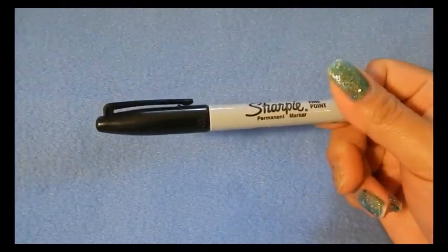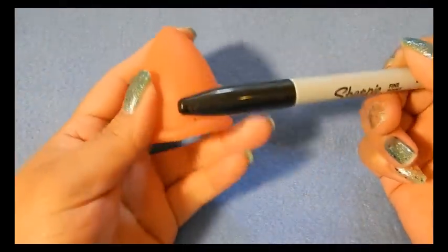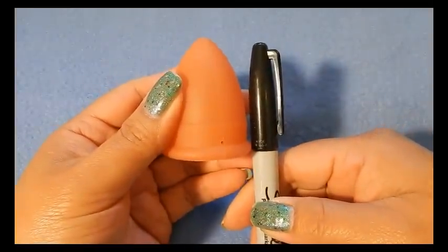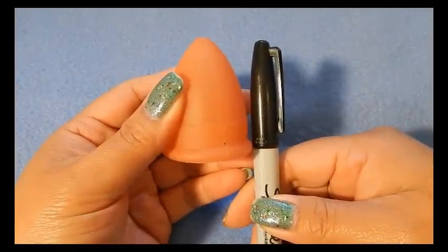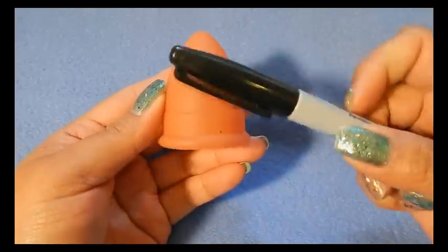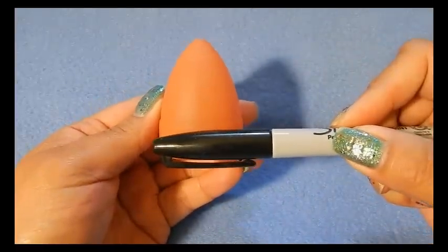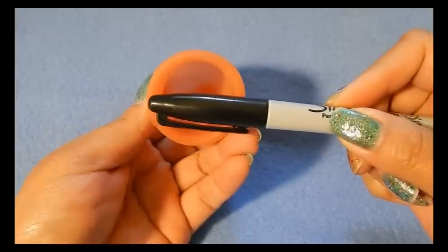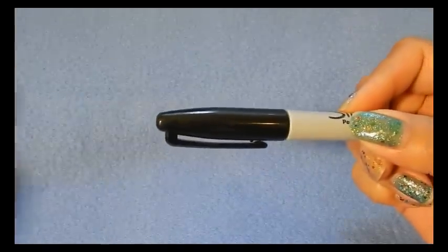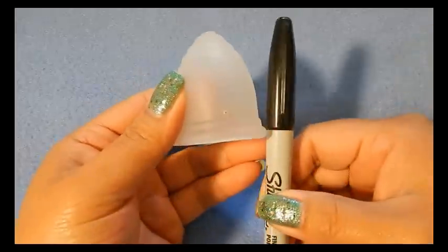I'll also use a Sharpie for comparison. The cups measure almost the same as just the cap alone, so I'm putting it up against the cap. That was the Lunette.